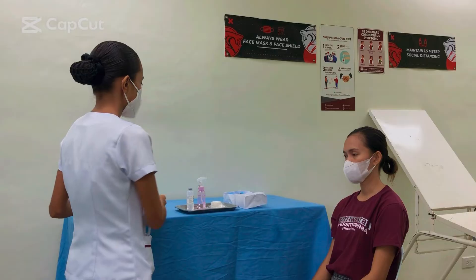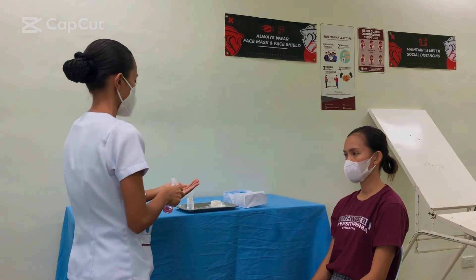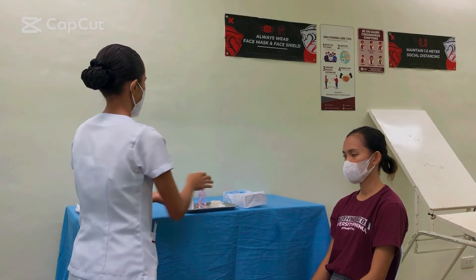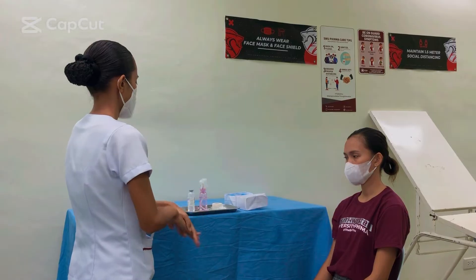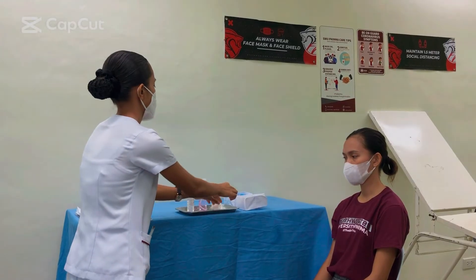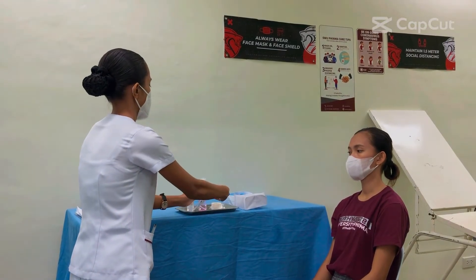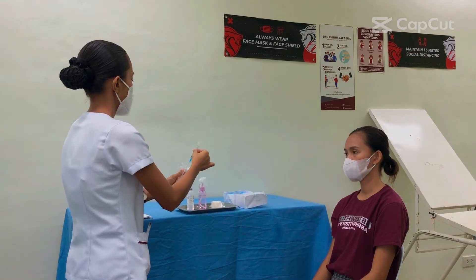Step three: perform hand hygiene. Aseptically prepare the correct medication dose from an ampoule or vial. Check the label of the medication two times while preparing the medication.